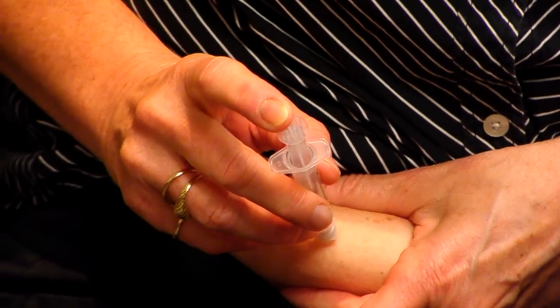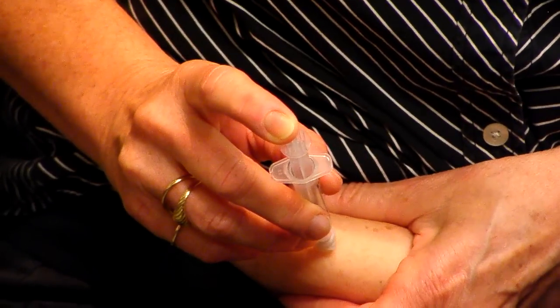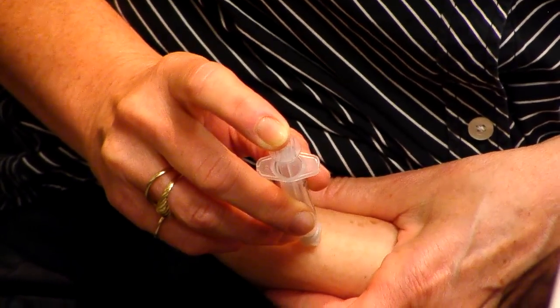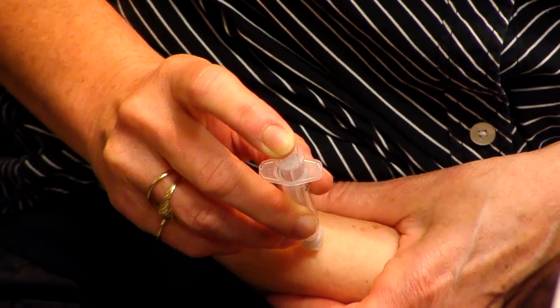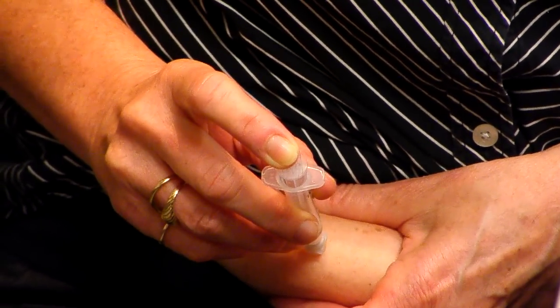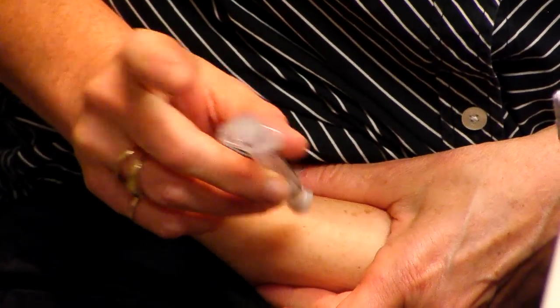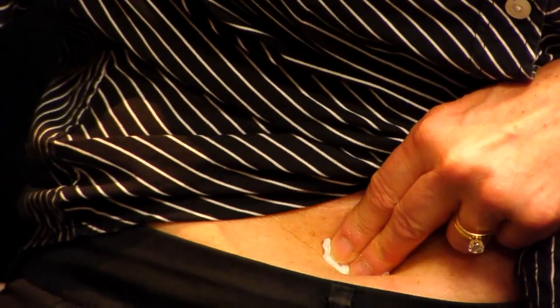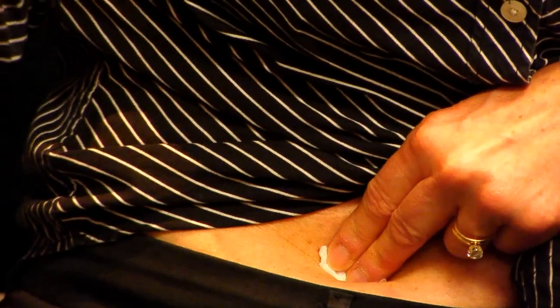You can use a one-handed technique. And then you push gently until the medicine goes in. And you pull it out. Place gentle pressure for 20 seconds, thereabouts. Don't have to rub it, just gentle pressure. And you're done.